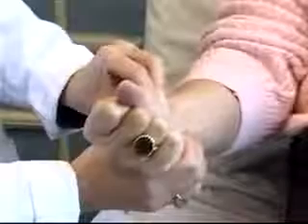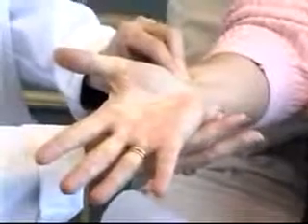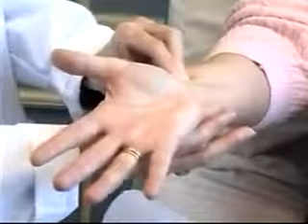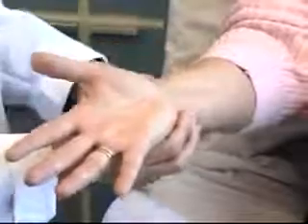After enough time has elapsed, I ask my patient to please release her fist. I release my grasp on the ulnar artery and watch for good flow returning to that hand. The hand pinks up again nicely. I now have a positive Allen's test and am okay to proceed with the procedure.